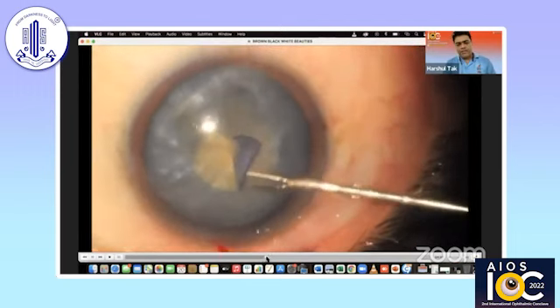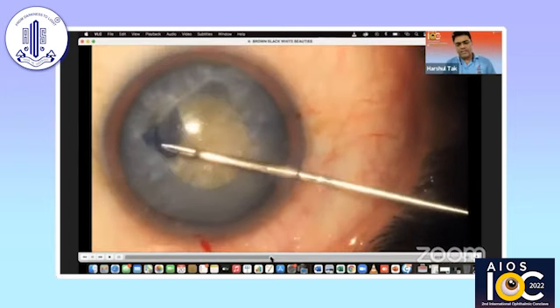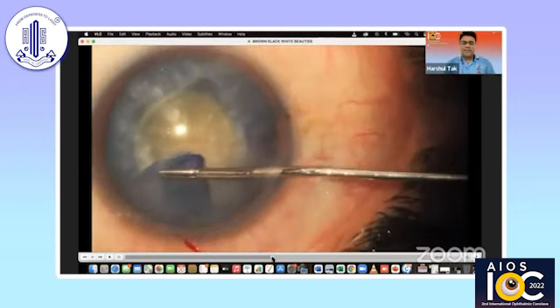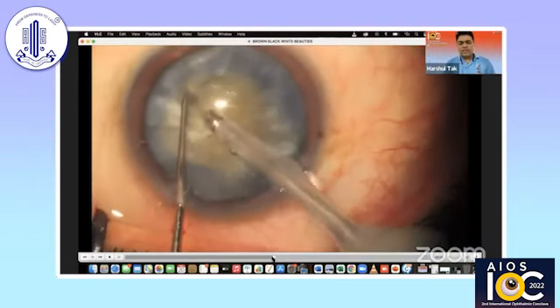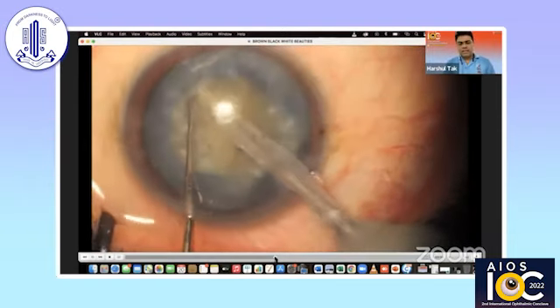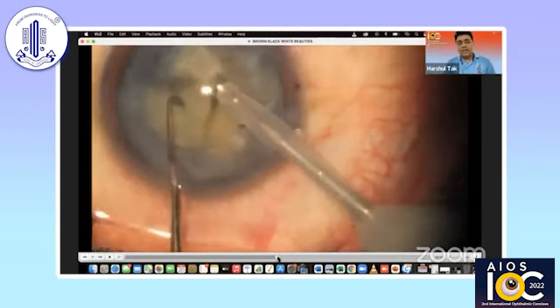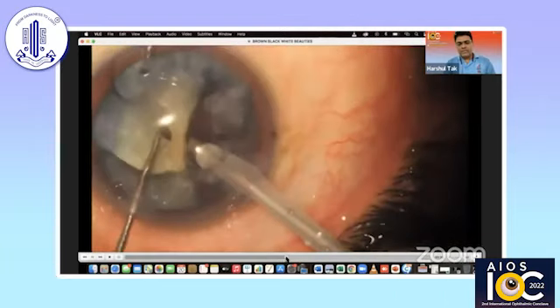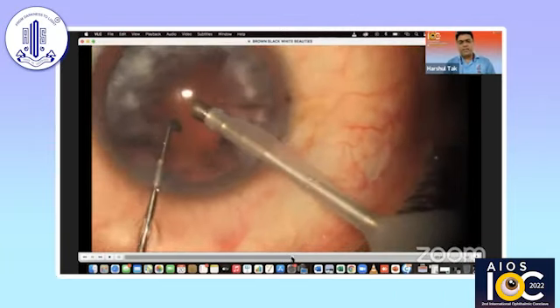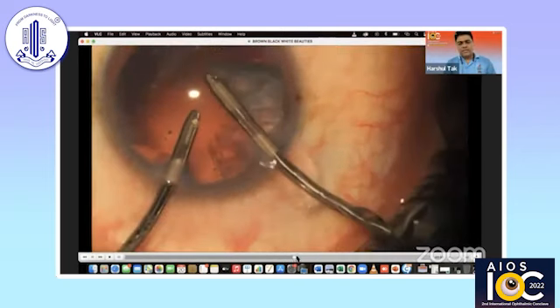You can make out that it's very easy to create a capsulorrhexis of adequate size in this cataract. This technique works wonderfully in intumescent cataracts and it's a very controlled technique that works in almost all cases. Chopping the nucleus is not a big deal — most of these cases have a brittle cataract which is easier to crack, but you need to be careful because there is no cortical support.